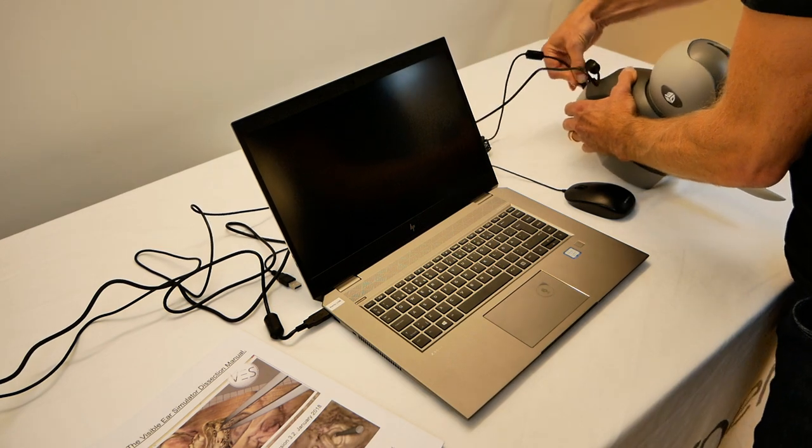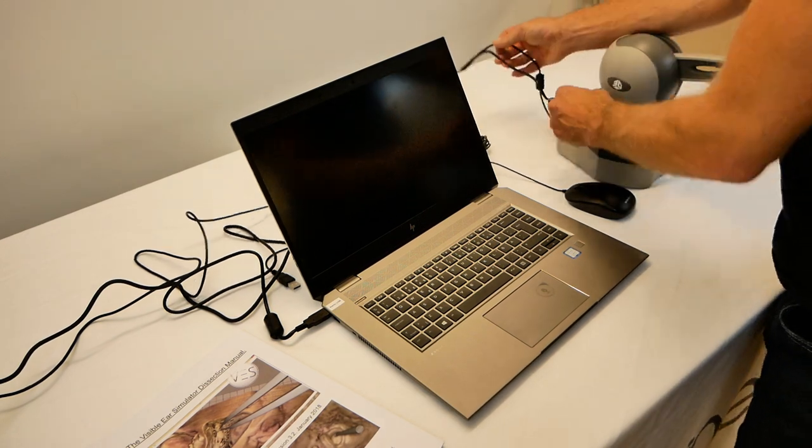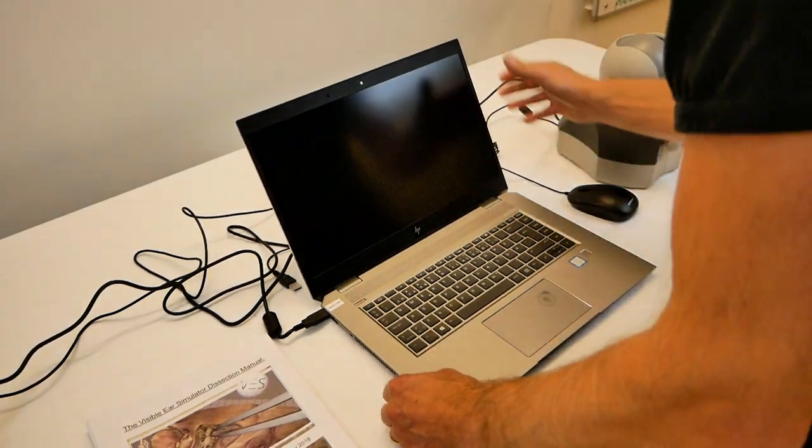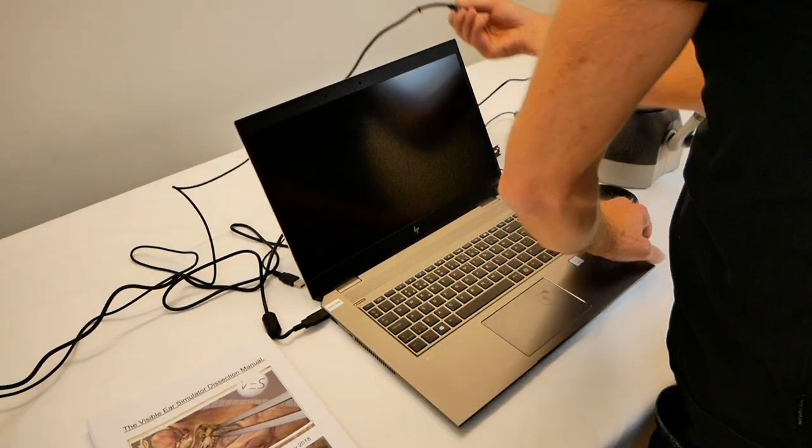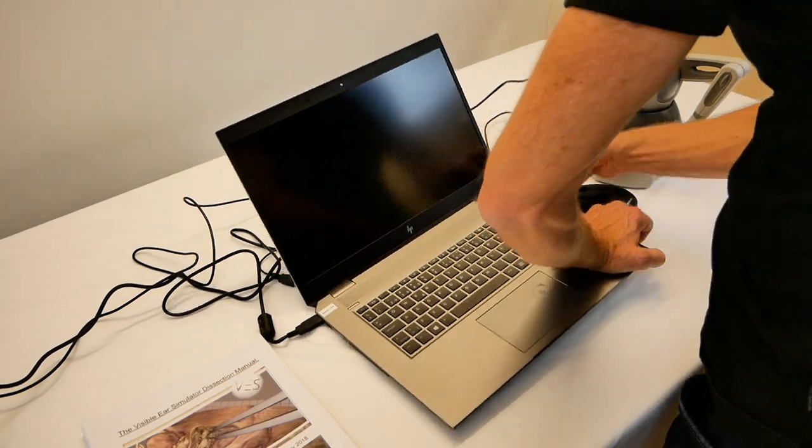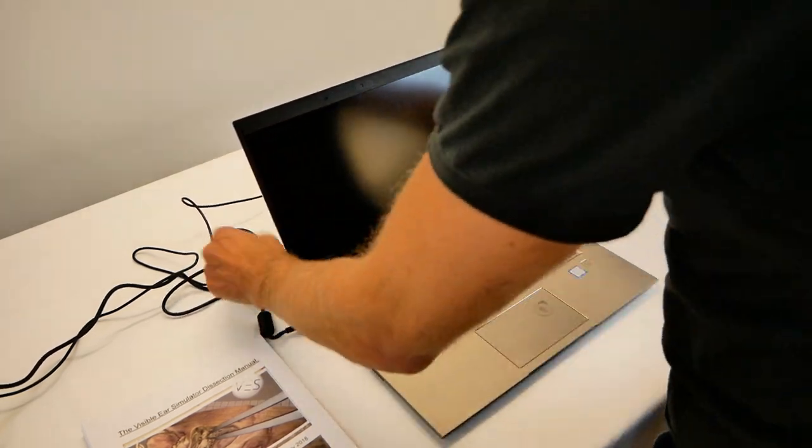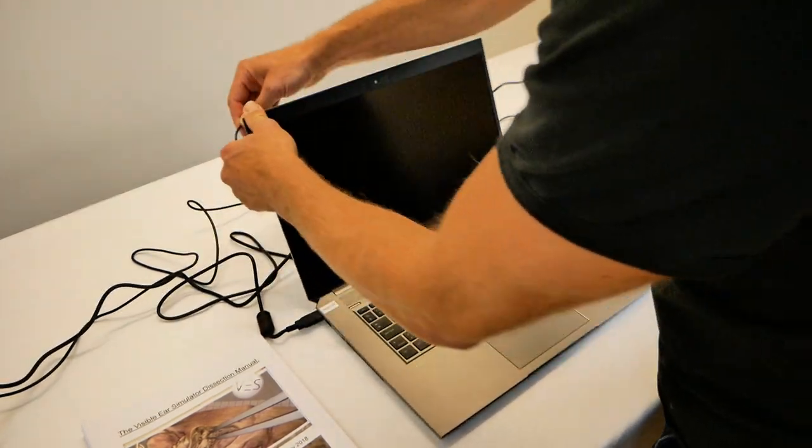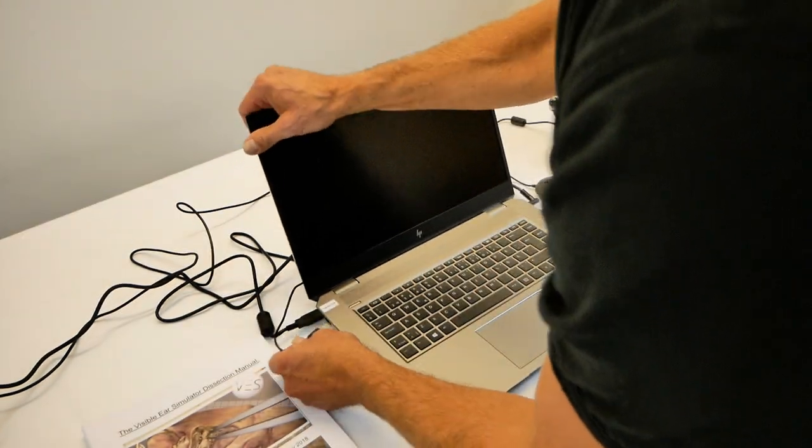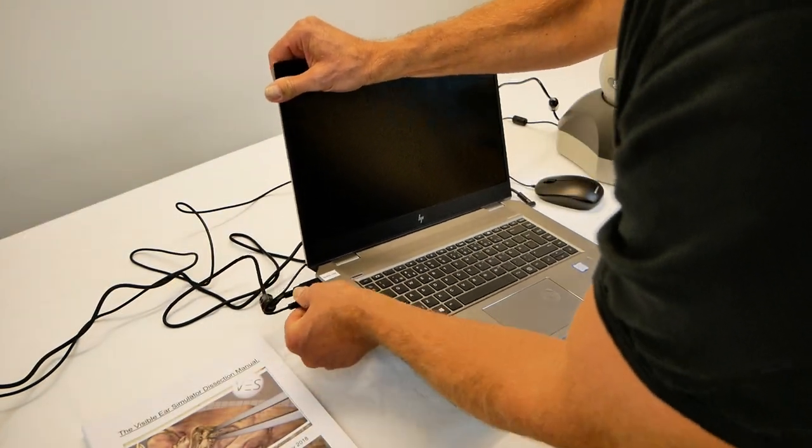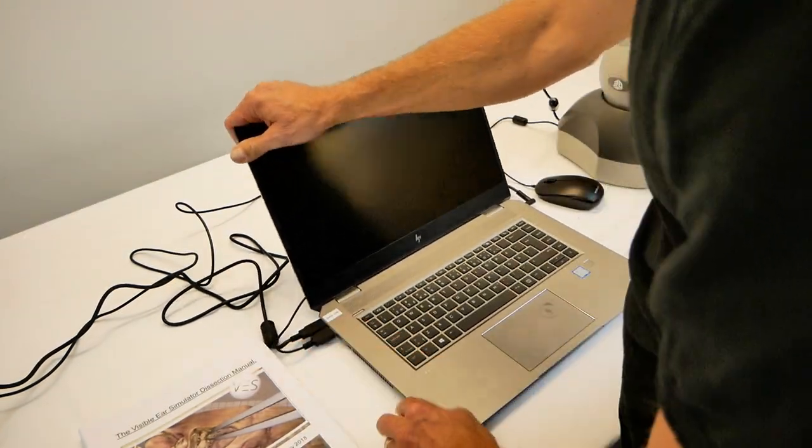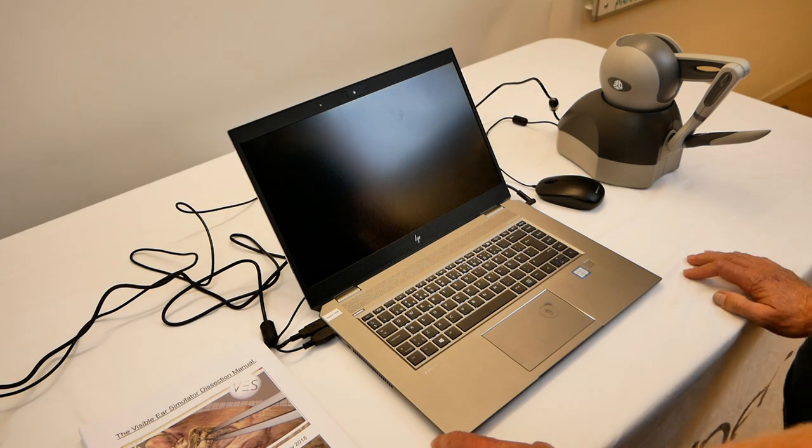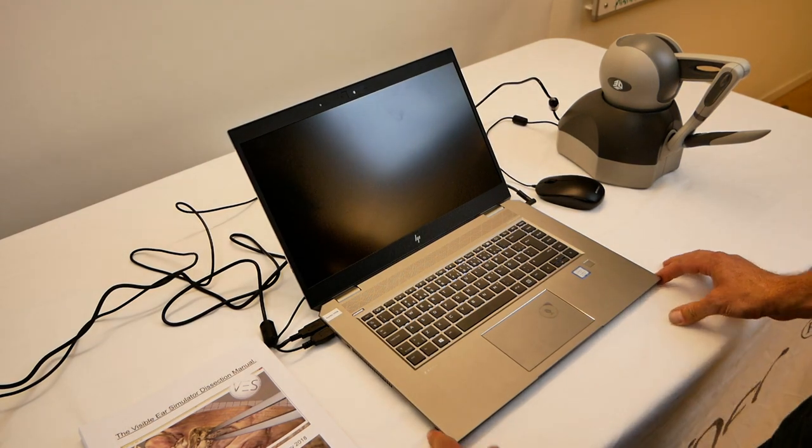We have the power cable for the haptic device and the power cable for the computer, as well as the computer mouse. And then we simply boot up the computer.